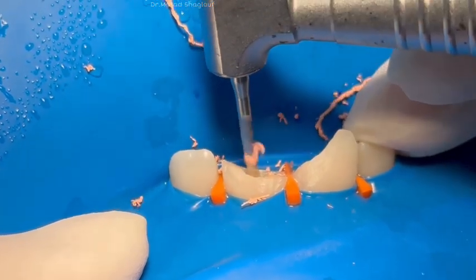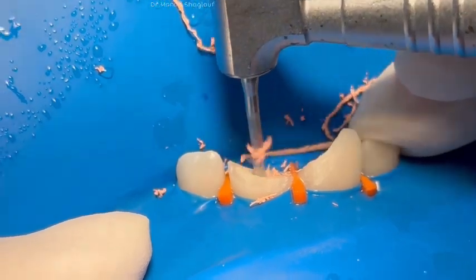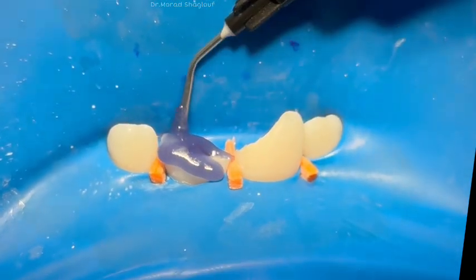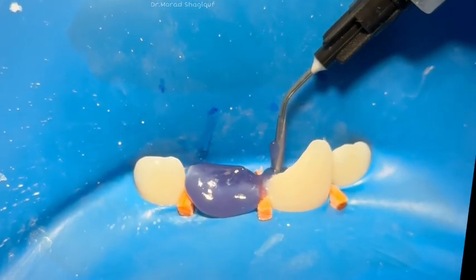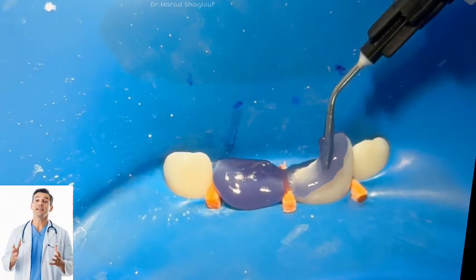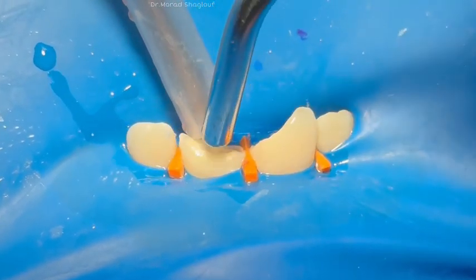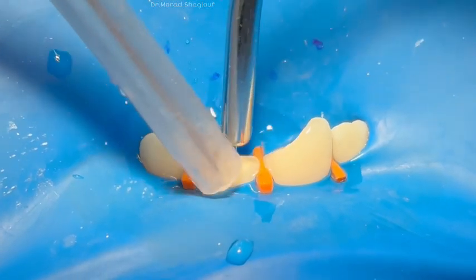After clinical evaluation, a fiber post supported restoration was selected. Fiber posts are commonly used in anterior teeth because they provide internal support while maintaining flexibility similar to natural dentin. The procedure begins with proper isolation and preparation of the root canal space. The canal is carefully cleaned and shaped to receive the fiber post, ensuring an accurate and stable fit.